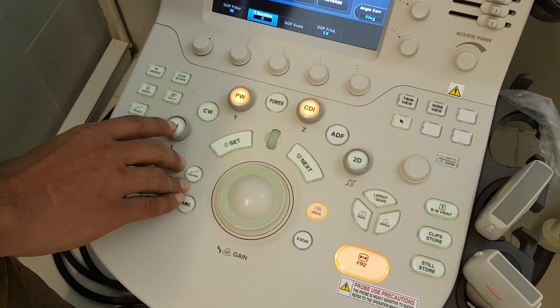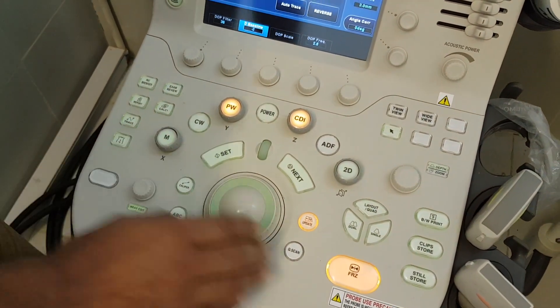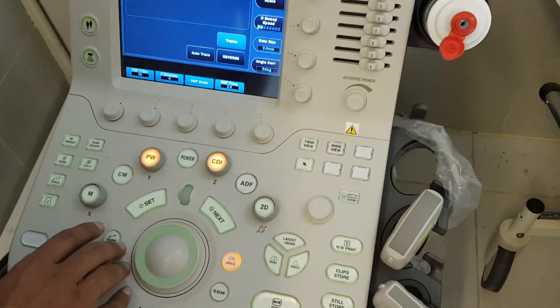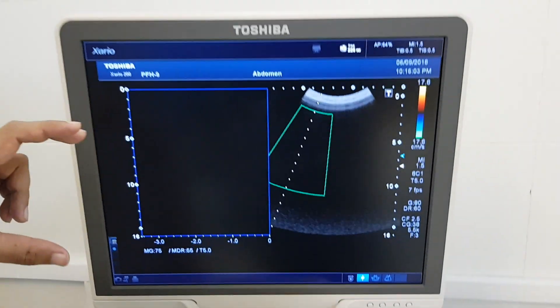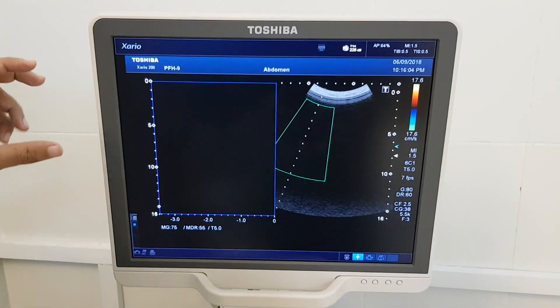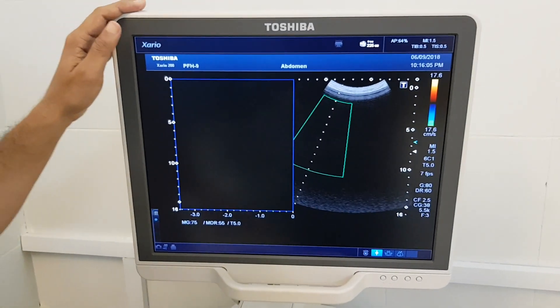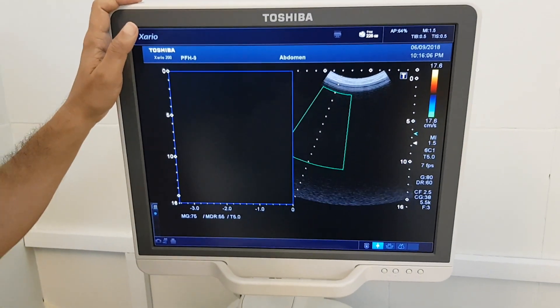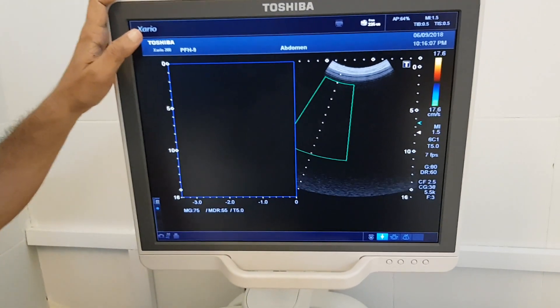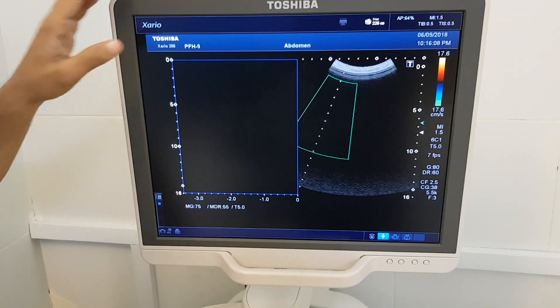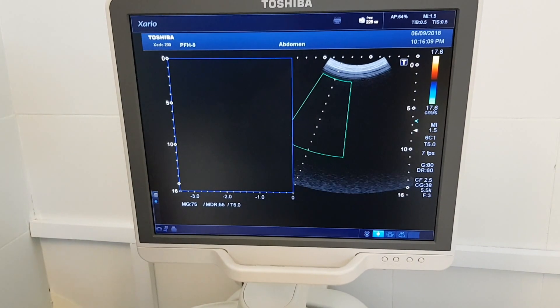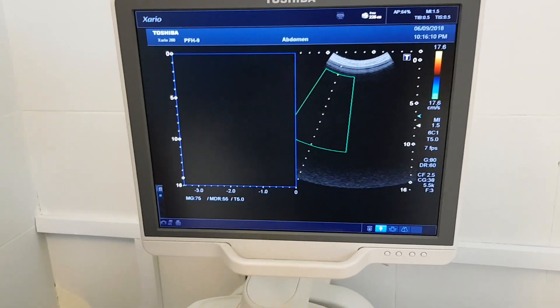The fourth important mode is M — M-mode. When we use it on cardiac ultrasound, we use M-mode for cardiac measurements.